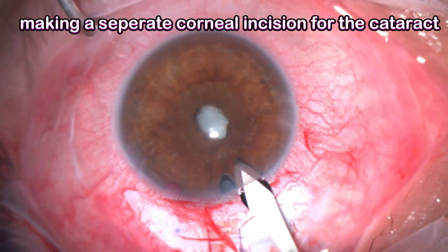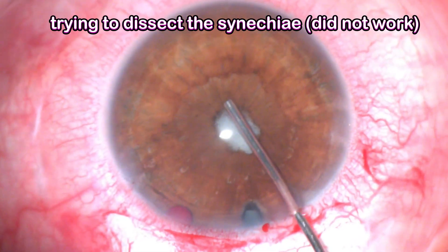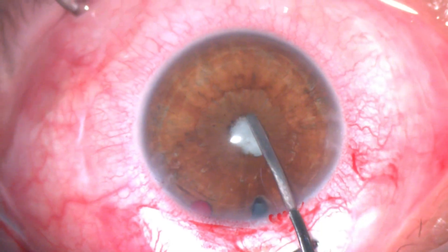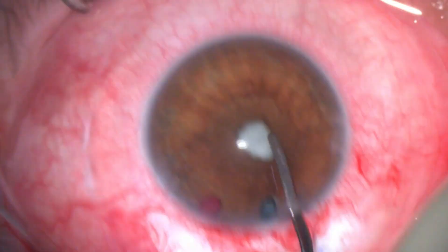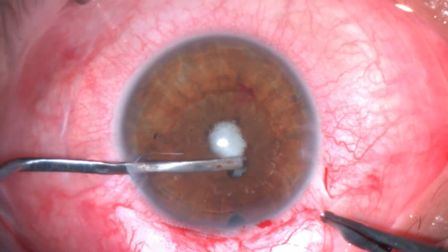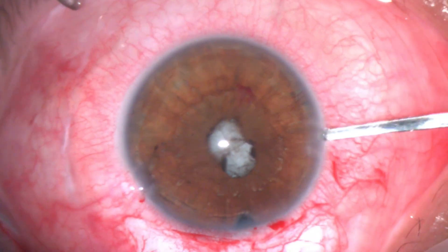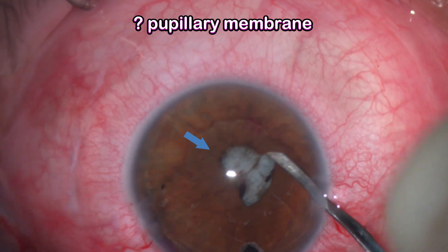Then moving to deal with the cataract, I made a clear corneal incision and tried to dissect the posterior synechiae. I tried multiple times but it didn't work. I recalled from the slit lamp examination there was an area with a small gap, so I started dissecting from that area, and bit by bit the synechiae were completely cleared.